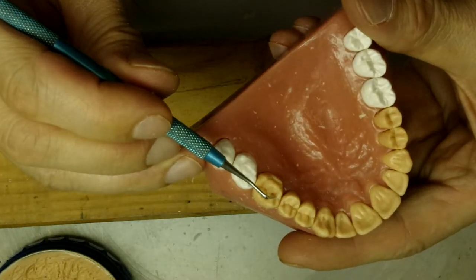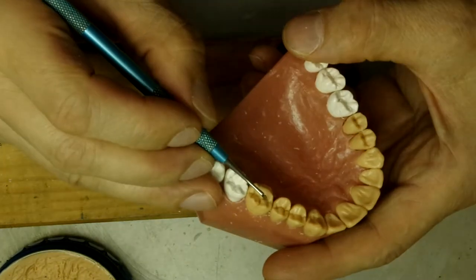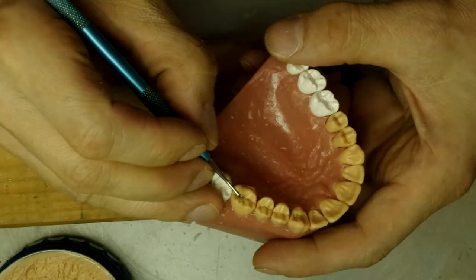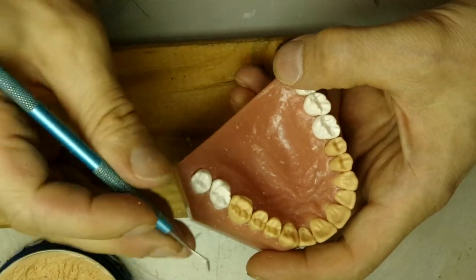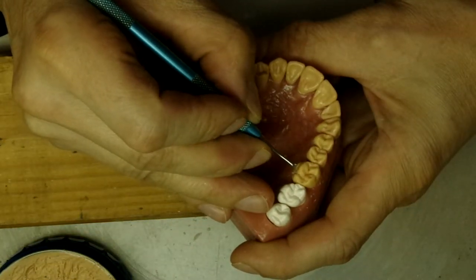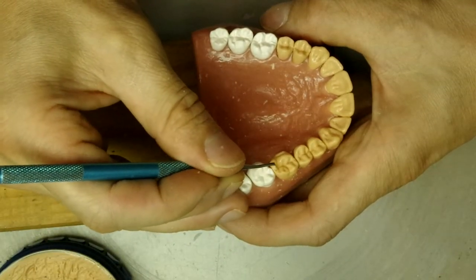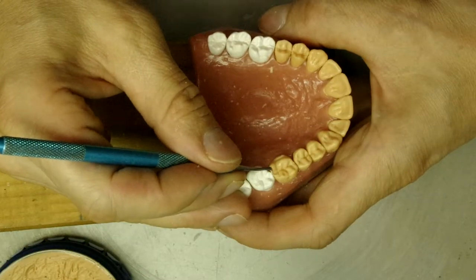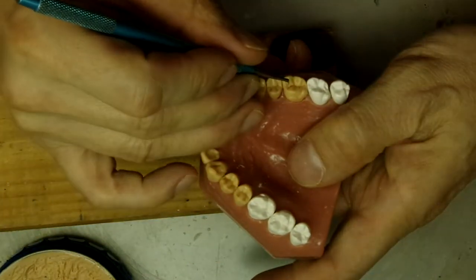It's sharp and then it shallows out. The sharp grooves are generally within the center of the tooth because that's where the lobes split. Then we make the mesial and the distal marginal grooves, or mesial and distal spillways.